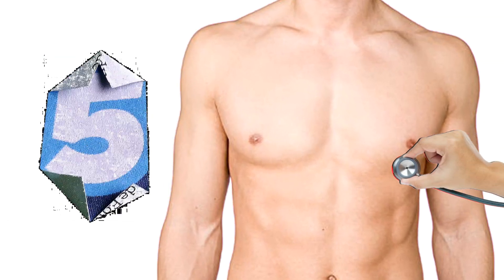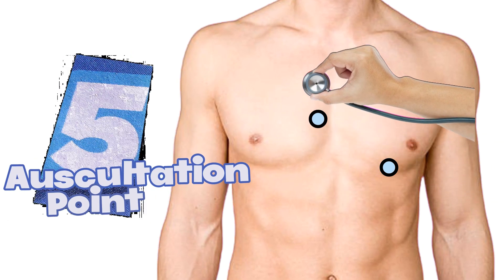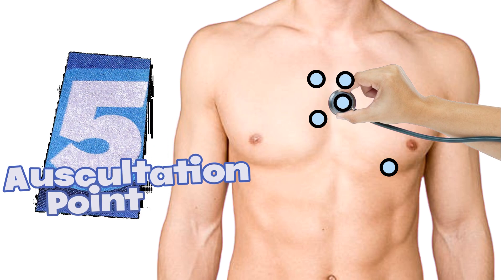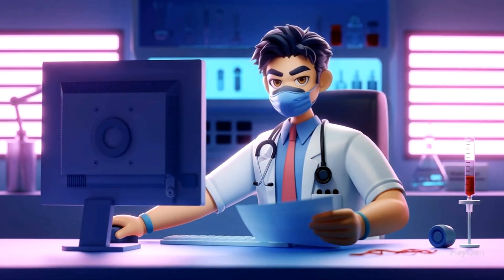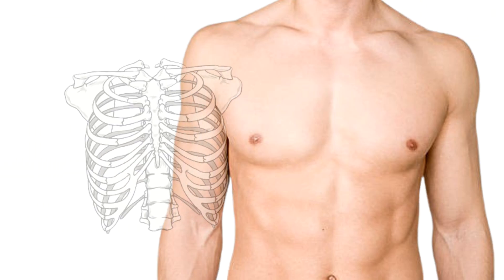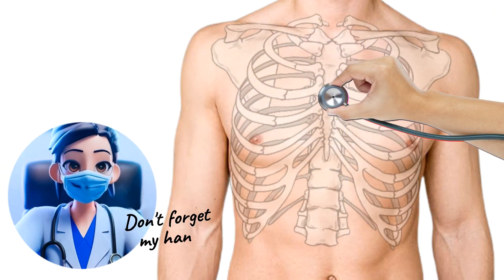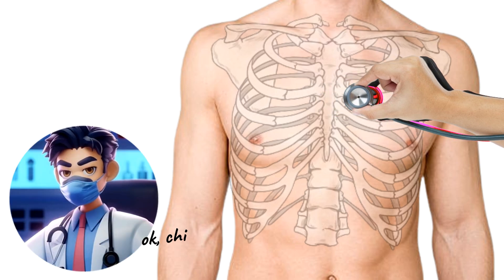There are five different points to auscultate to learn all kinds of heart sounds. Let's learn these one by one. We are going to use this animated ribcage to learn. Don't forget my hand with the stethoscope.